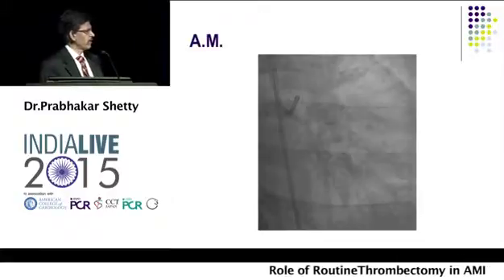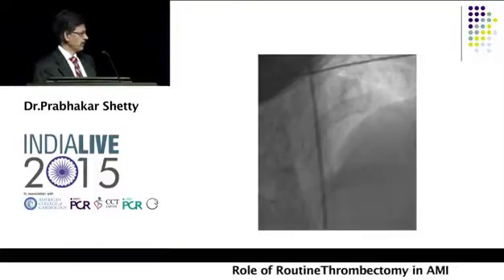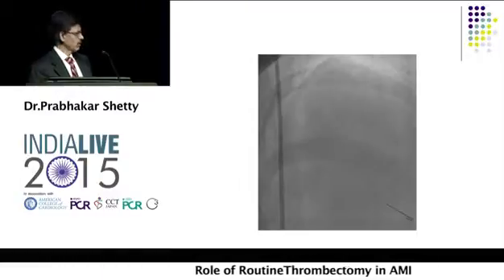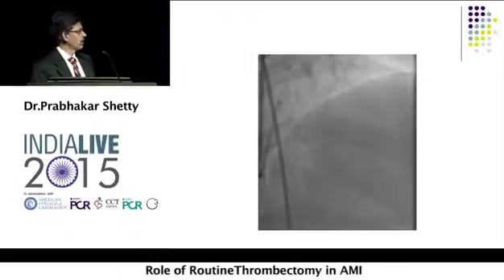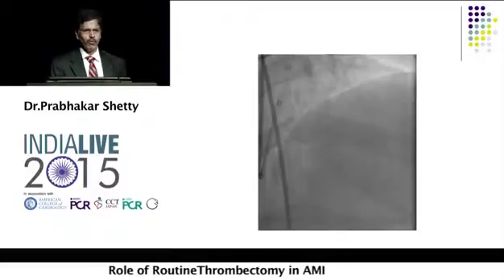This is another 45-year-old gentleman who presented with anterior wall ST elevation MI. LAD is totally occluded, distal, mid. So again, just thrombus aspiration. Sorry, it's not playing. So complete recanalization, no balloon or no stent.